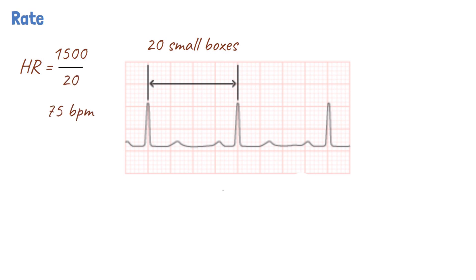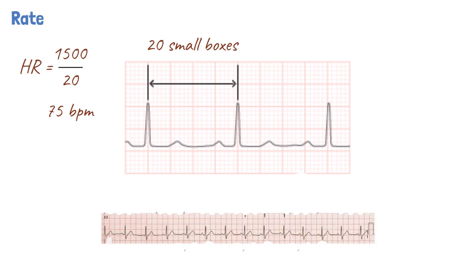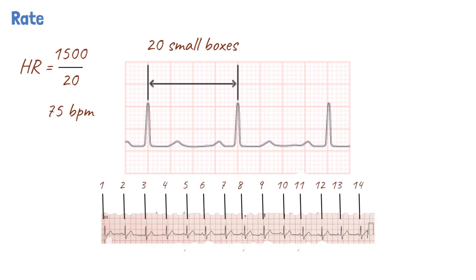The calculation of the heart rate becomes more difficult when there's an irregular rhythm such as atrial fibrillation. Under these circumstances, the rate can be calculated by counting the number of QRS complexes on the rhythm strip provided across the bottom of the ECG and then multiplying this number by 6. For example, in the ECG strip shown, there are 14 QRS complexes in the rhythm strip, which gives 84 beats per minute.